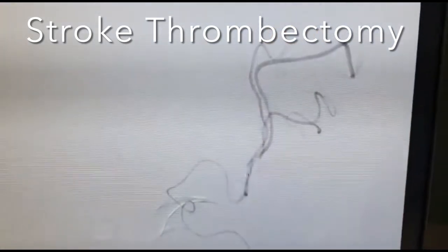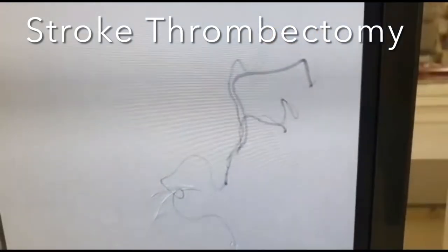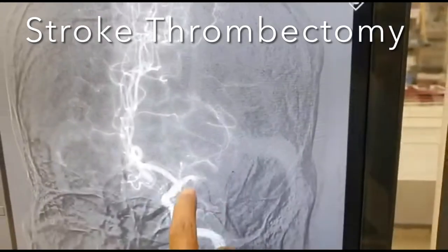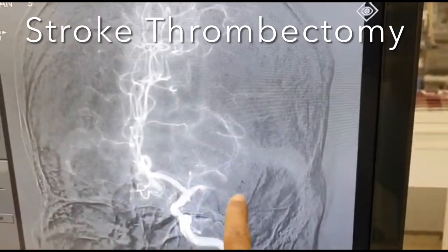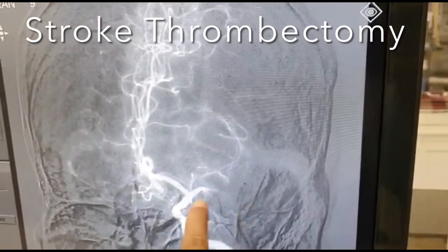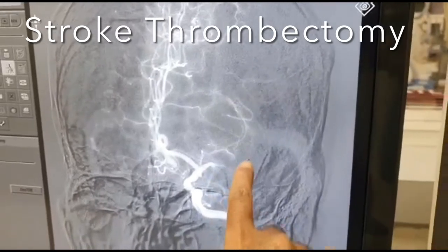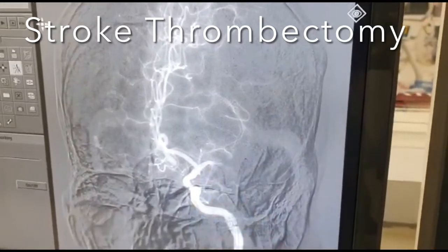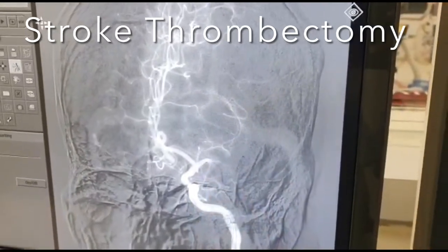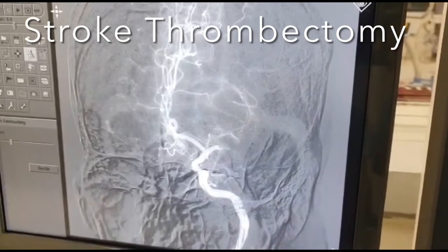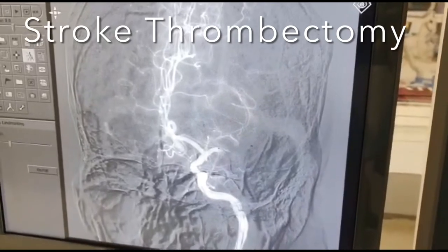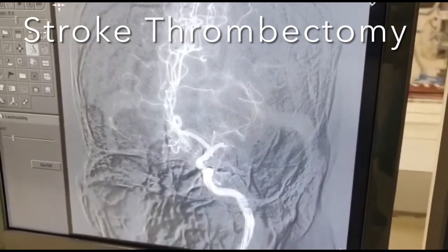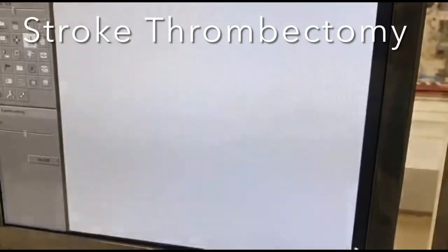Check angio is done to see the patency of the distal vessel, following which a stent retriever is deployed. You can see the stent retriever in the lower division deployed across the clot. It is left there for 5 minutes, following which the stent retriever is withdrawn.